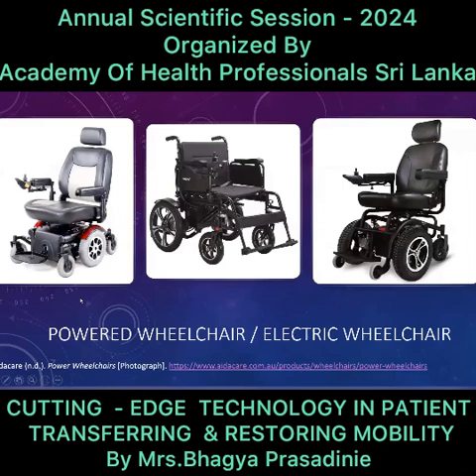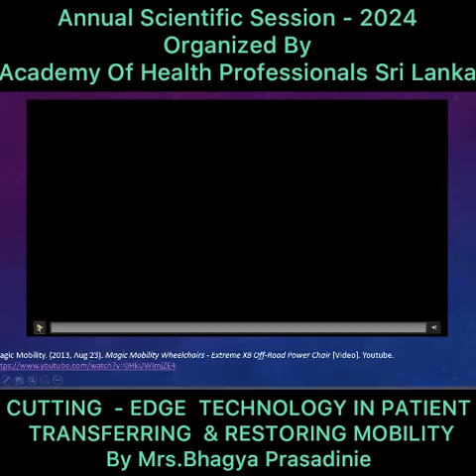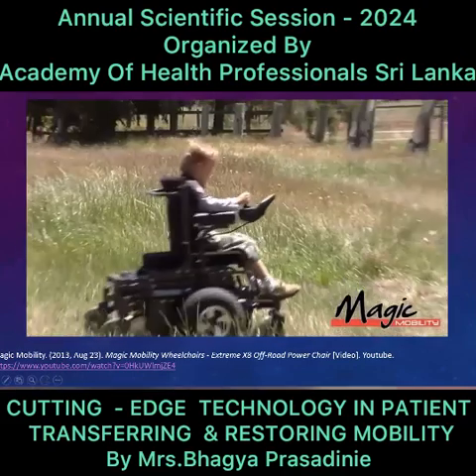So next, the most important, powered wheelchairs. In the Sri Lankan context, I have seen powered wheelchairs. These electric wheelchairs are used with electric power, and we can use them indoors as well as outdoors. So there are two types of mobility devices as such. This one is a powered wheelchair, and there is another one called a mobility scooter, which we will discuss in the next slides. So for this powered wheelchair, you can have a look at how it works.